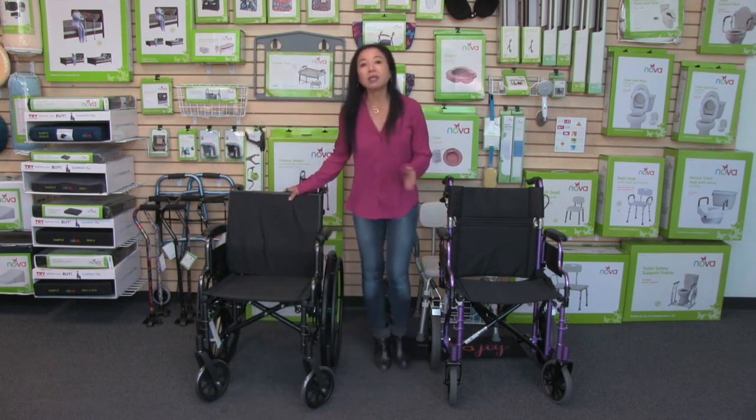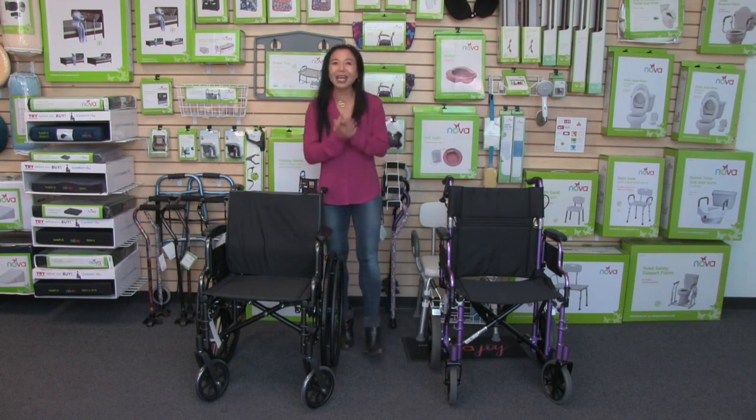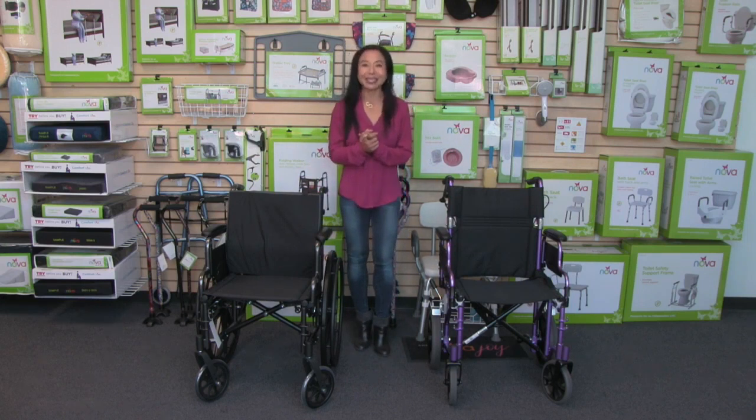This cushion comes in a 16-inch width and also an 18-inch width. And as with all of our products, it comes with our care, use, and contact information so you can reach out to us anytime.